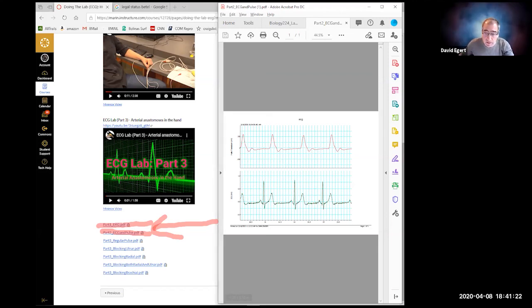I can annotate again. It was basically, QRS is where the ventricles are contracting, and here's where we see the pulse showing up at the finger. So we measured from there to there and looked at that distance. Okay.